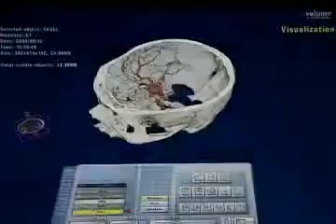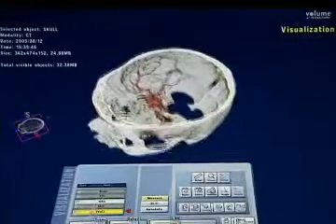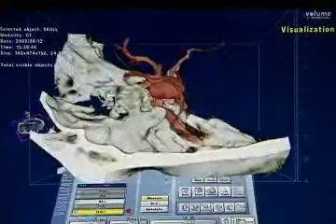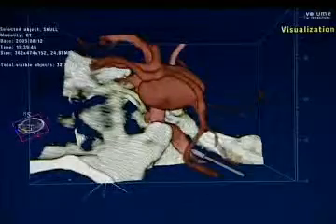You don't have that other aneurysm loaded up, do you? Well, I started playing around today, actually, at the booth, looking at what we could possibly do. And I'll show you here, we just ran through this. This is a large left-sided carotid artery aneurysm. It's a proximal supraclinoid internal carotid artery aneurysm. And maybe put this into a left pterional view.